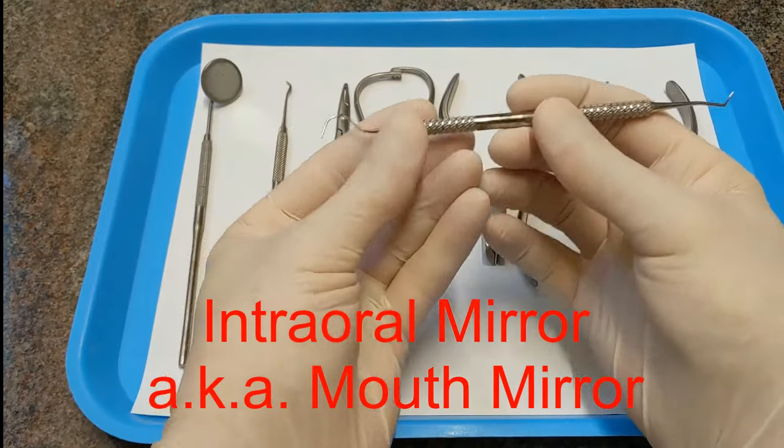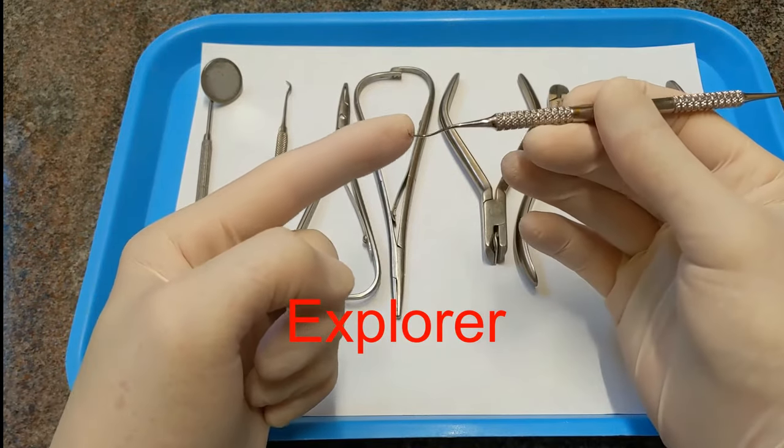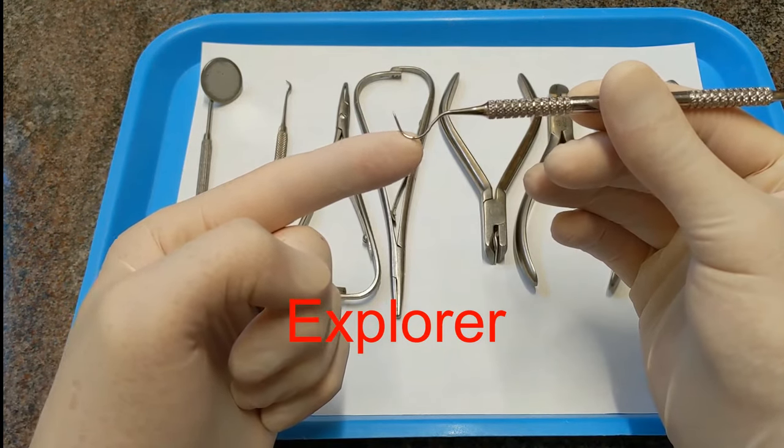This is called an explorer. This end is called an explorer — it's like a spike. You use this to take off the colors or the otis from a patient's braces.